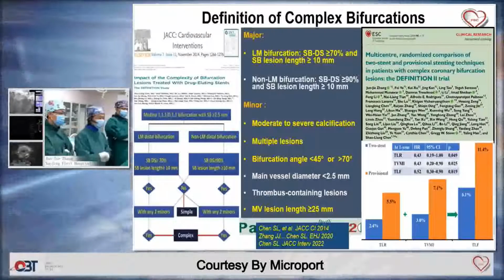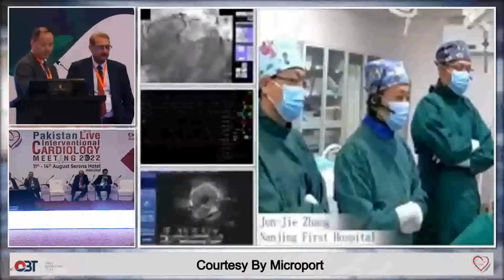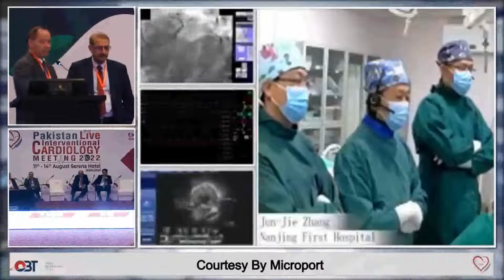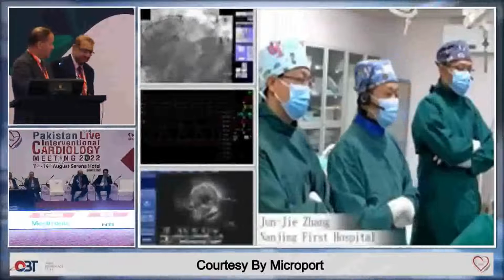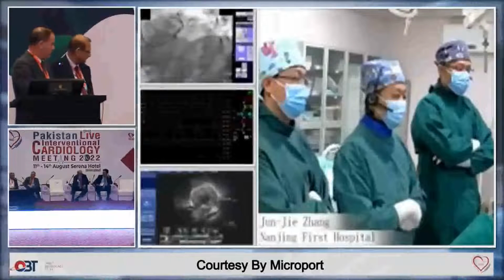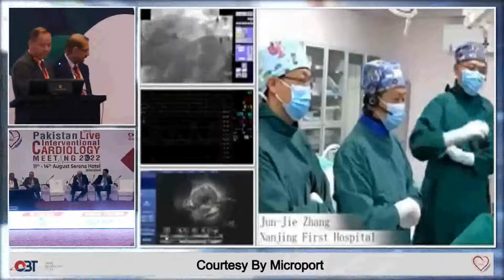So actually, from the baseline angiography, it looks like a trifurcation of the left main. We also have a strong panel, so I have some comments from panelists. Hey, Junjie, this is Tanvir. How are you? You okay? Yeah, great to meet you, Tanvir.